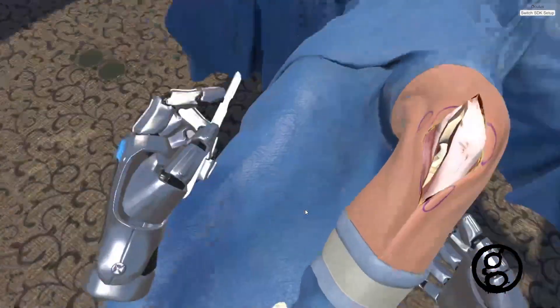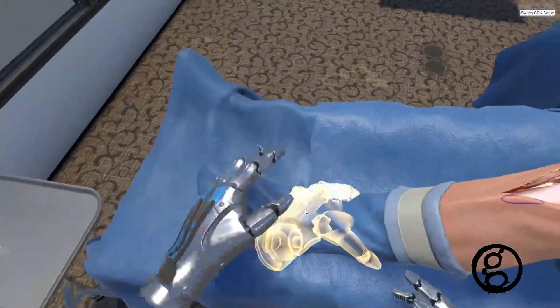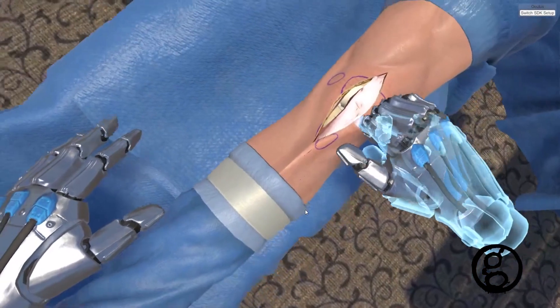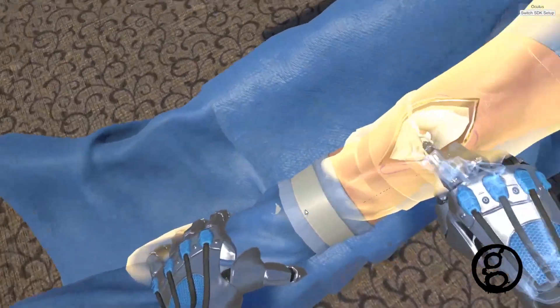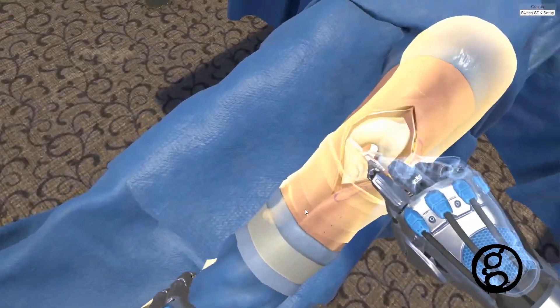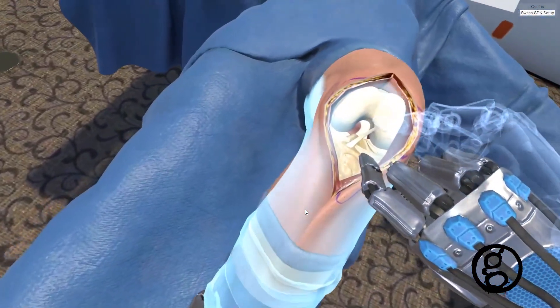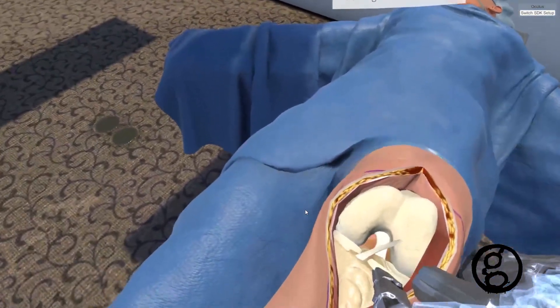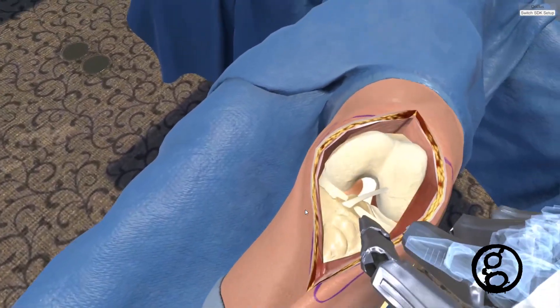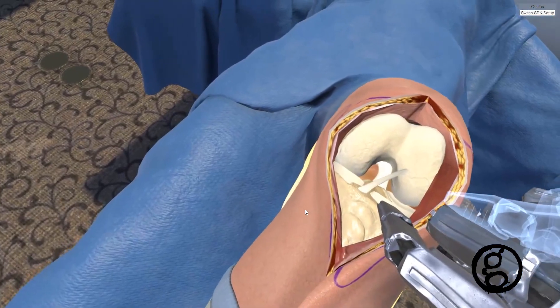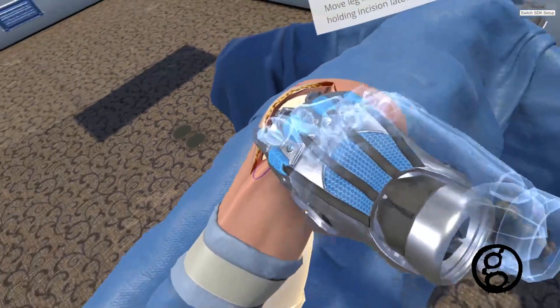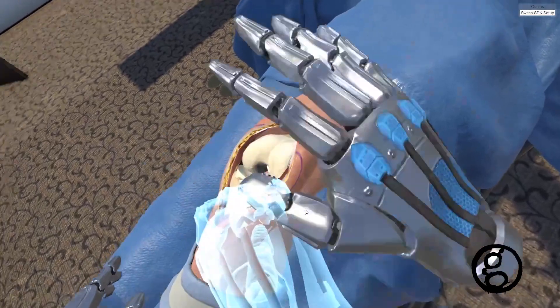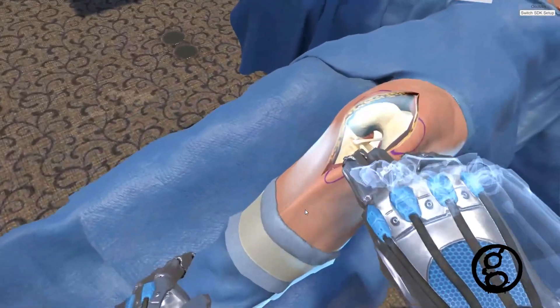Grasp the patient's left ankle, preferably with your left hand. Now manipulate the leg. Now manipulate the leg to reposition the knee into 90 degrees of flexion. You must grasp and hold the leg to manipulate it.